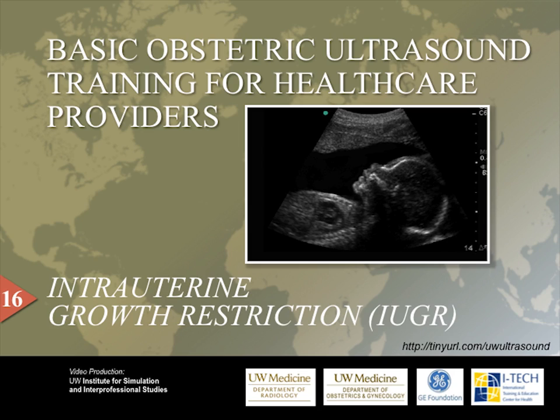My name is Dr. Christina Adams Waldorf, and I will be narrating this 16th video in our pregnancy ultrasound series. This video will focus on the normal and abnormal growth of the fetus. Please visit our website for access to all of our video and training materials.